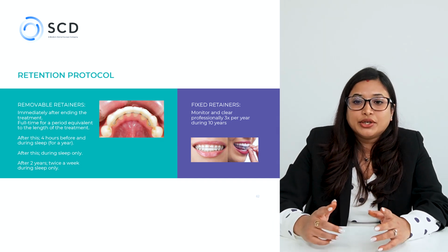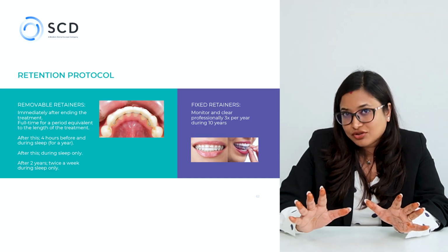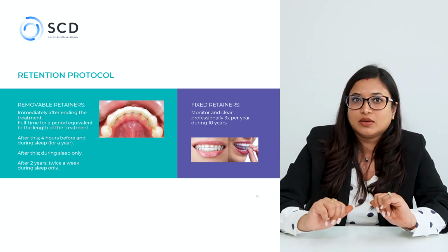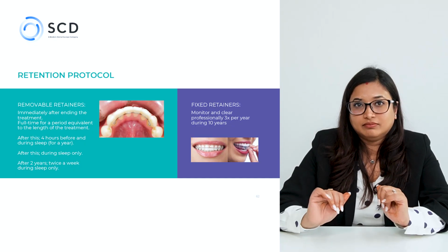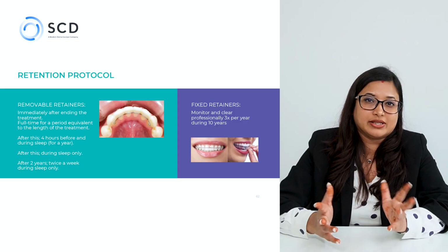Fixed retainers should be monitored and cleaned professionally 3 times per year over 10 years. With fixed retainers, patients usually do not have to do much about it. There's no compliance issue there. You can just fix it once and be relaxed that it will be there. But having said that, patients usually prefer removables because they're not visible and they're more aesthetic.